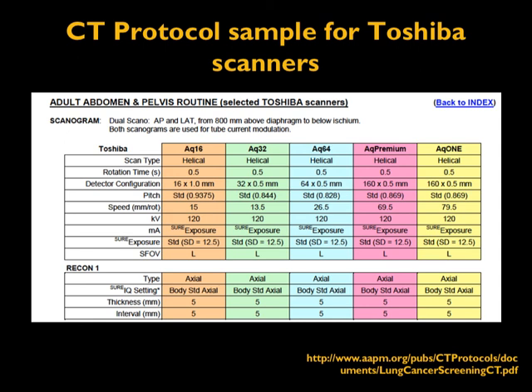So in conclusion, it is important that we have the scanner picked which has minimal downtime and meets the needs. Therefore, identifying the needs of a particular scanner becomes very important.